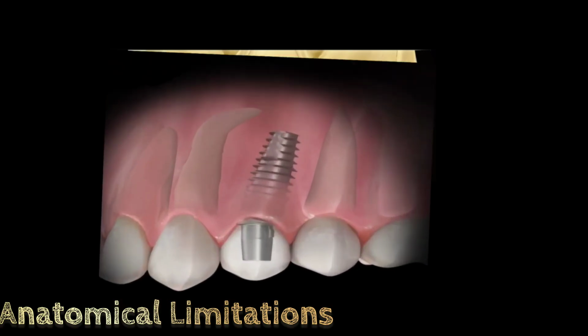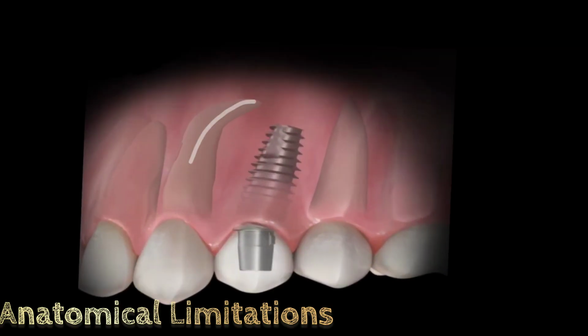Sometimes severe dilacerations or root curvatures may also force the surgeon to incline the implant to avoid them.